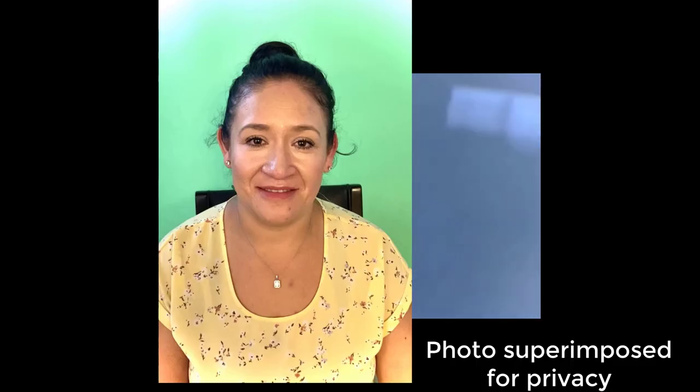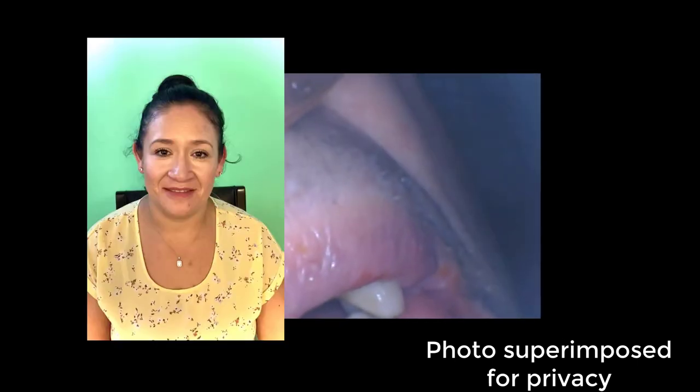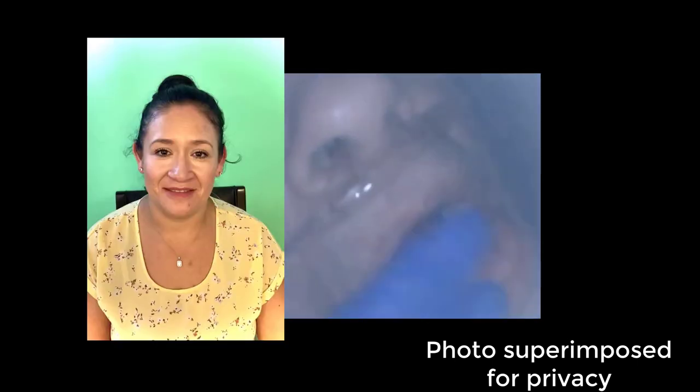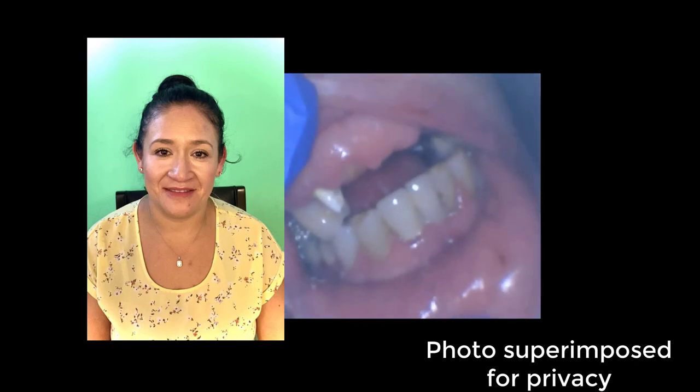The tips I have for good picture taking: use two fingers if you're by yourself just to brace the picture.